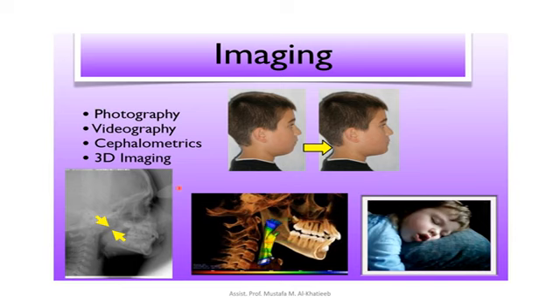Also imaging, photography, videography, cephalometrics, and 3D drawing of the airway through lateral cephalometrics or by CBCT. And also we notice the children during sleeping by taking photographs by the parents.